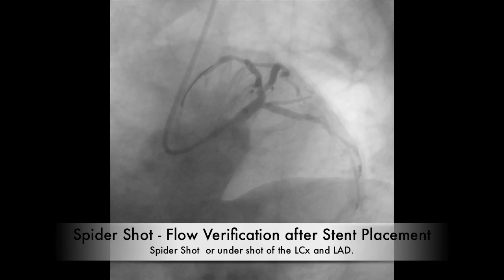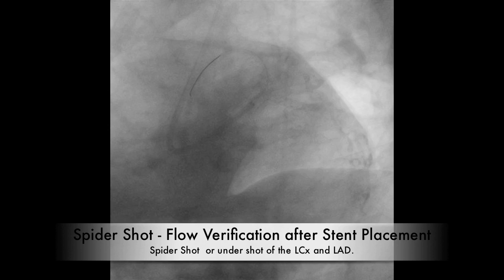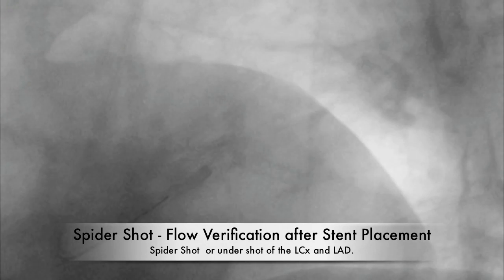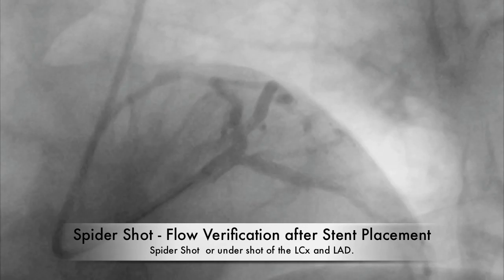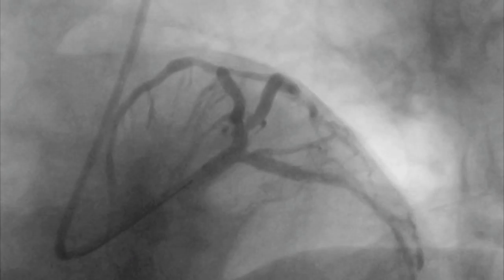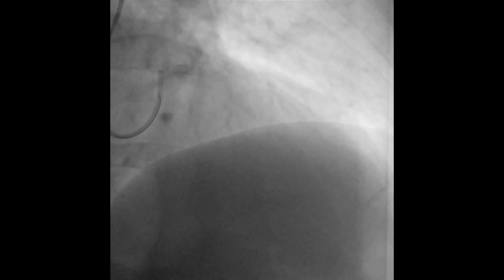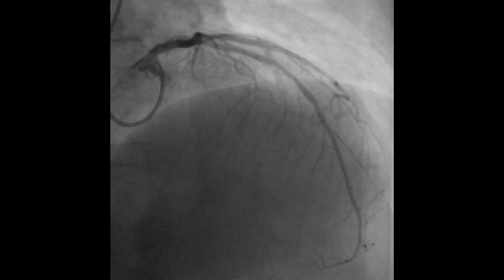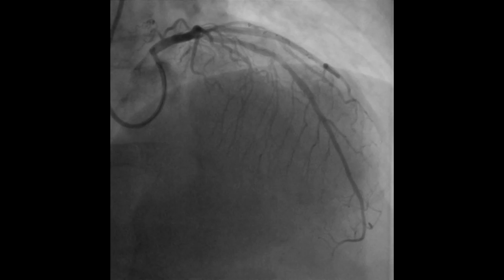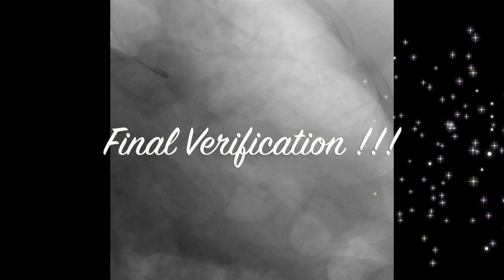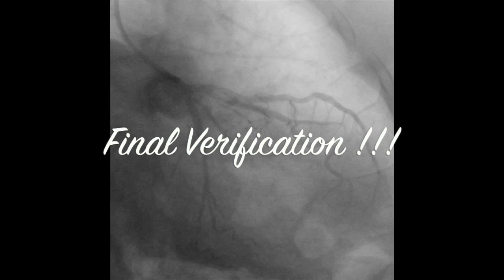Now they're going to do a spider flow shot verification of the stent placement — injecting media into it. You can see the LCX and the LAD; the flow looks really good. Here's a side shot of both the LAD and the LCX — the final shot. Now the final verification flow check — it looks good.